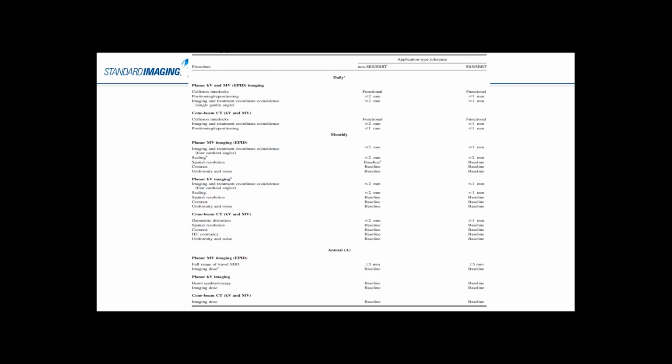In addition to the Linac-based SRS QA tasks, there are also several imaging QA requirements that the Lucy Phantom is equipped to handle as well. For example, the Lucy Phantom has specialized inserts for analyzing many of the image quality parameters for both CT and MRI-based planning images, along with assessing the image localization for daily verification of patient position.